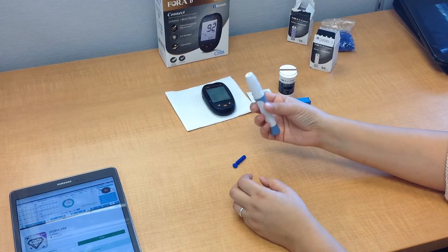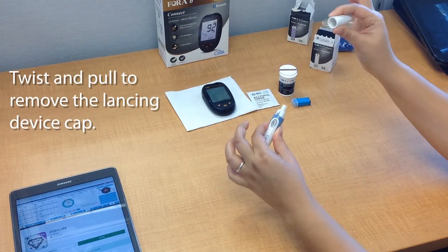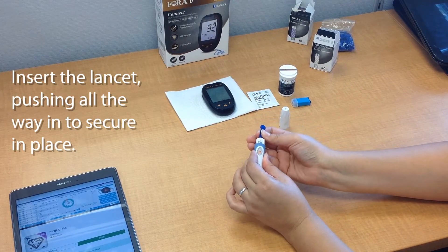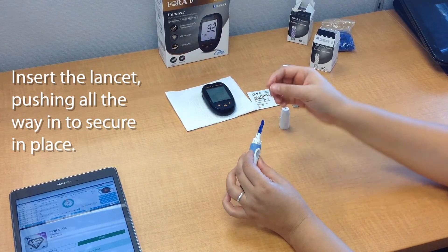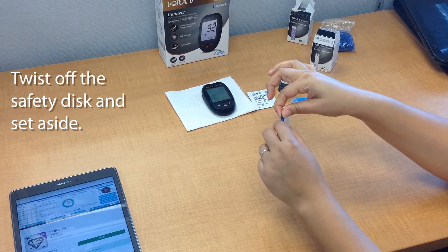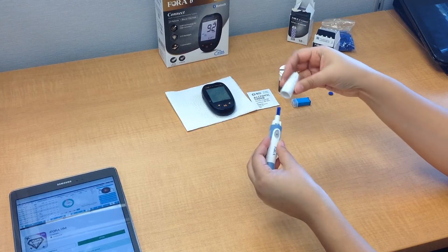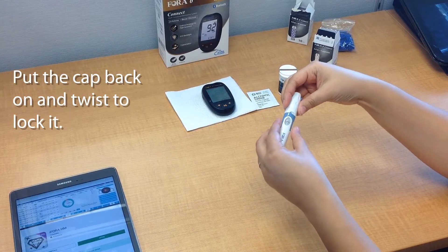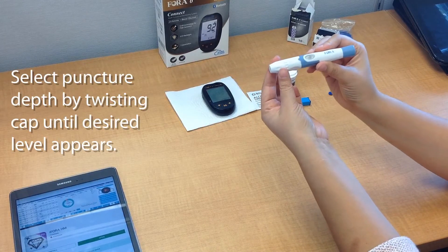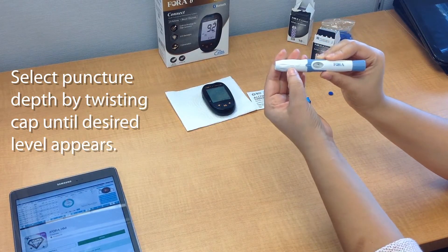Now let's prep our lancing device first. Go ahead and open the device by twisting the cap and then pulling it off. Then insert the lancet in — make sure that it's all the way in. Then you're going to twist off the safety disc and remove it. This will expose the needle for the test. Put the cap back on and lock it. Now you're going to select the depth of penetration from the needle — you can see the little wedges right here on the side.